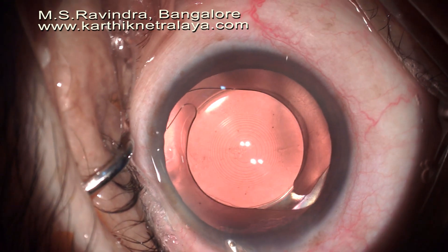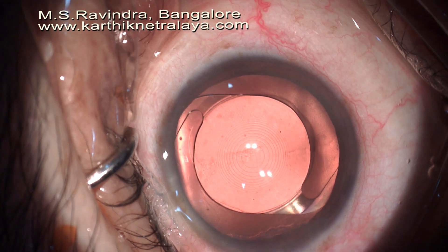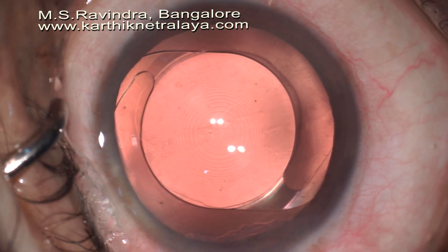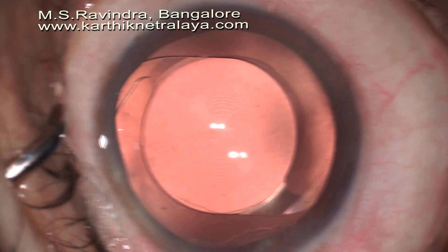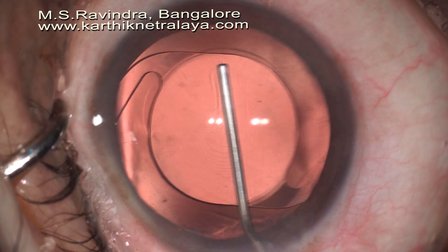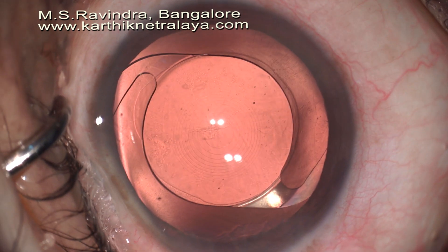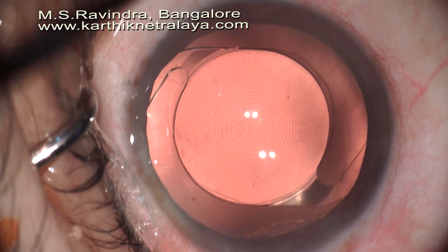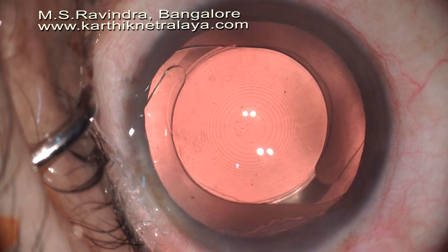The lens is well centred and I am very happy with the results. Moxifloxacin was placed in the capsular bag at the end of surgery, the eye is kept open, and the pressure is normal at the end of surgery. The patient was advised adequately to avoid any further injury to the eye in the days to come.